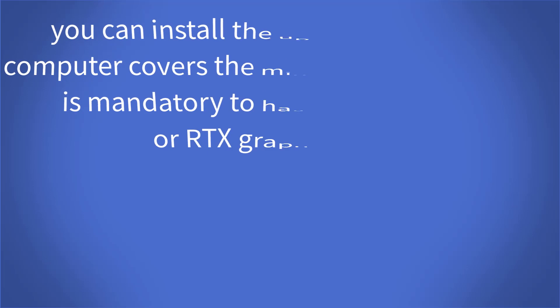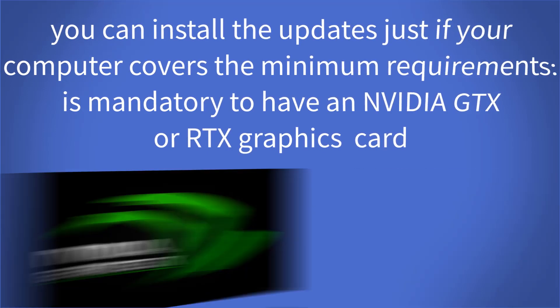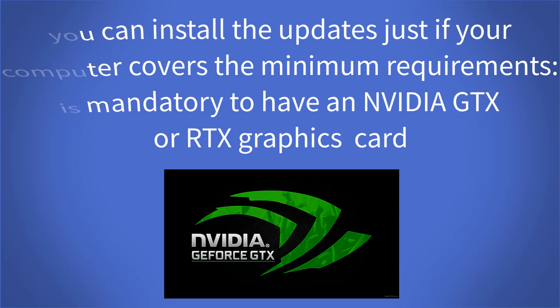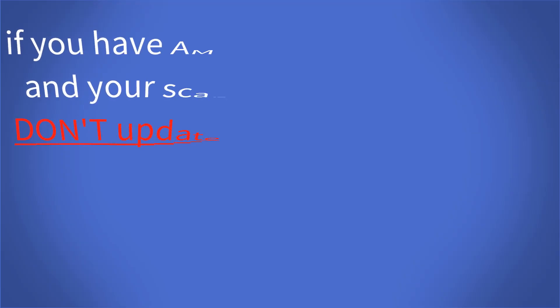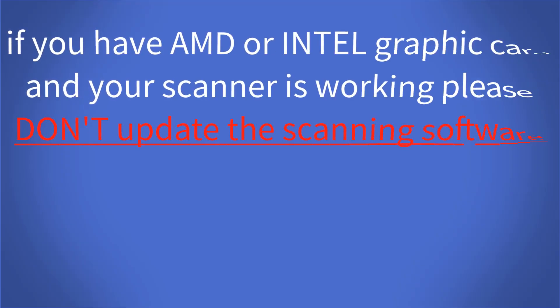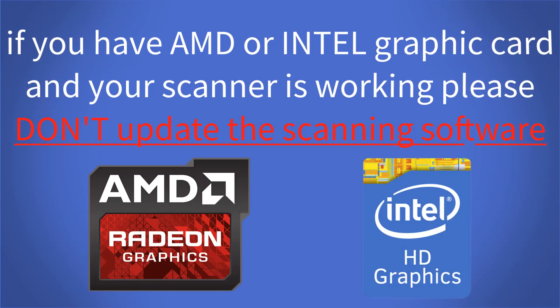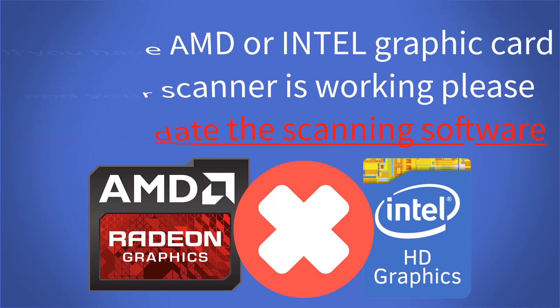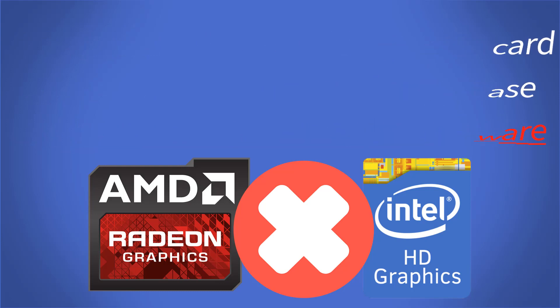Remember that you can install the updates just if your computer covers the minimum requirements. It's mandatory to have NVIDIA GTX or RTX graphic card. In case you have AMD or Intel graphic card, please skip the updates and continue to use the software version that you already have inside your computer.